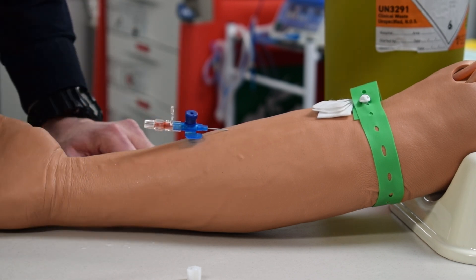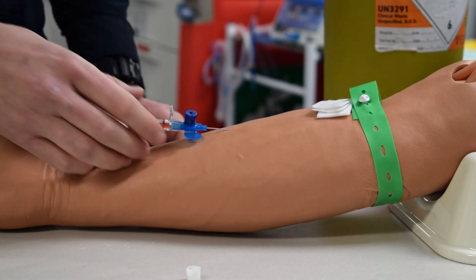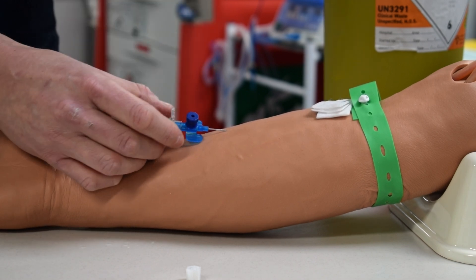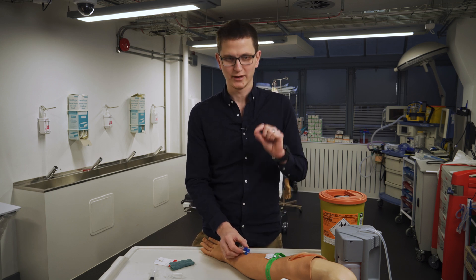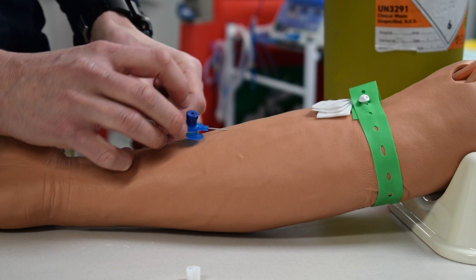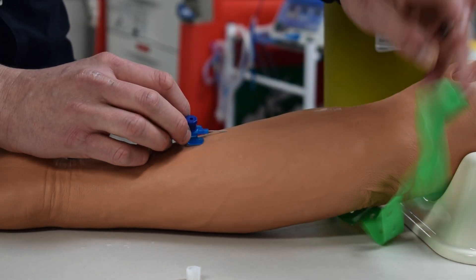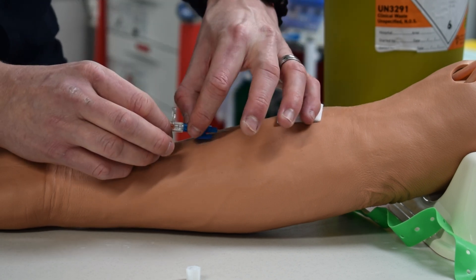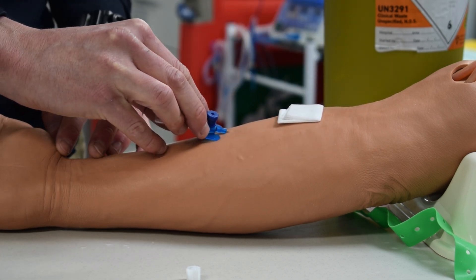As you can see, we're having our first flashback — the back of this cannula is filling up with blood. Now the best advice I can give is advance it about a millimeter. That ensures the plastic bit around the metal bit is inside the vein. Then we flatten it down and push the cannula in — this can be done with one hand or two hands — just advancing the plastic piece in.